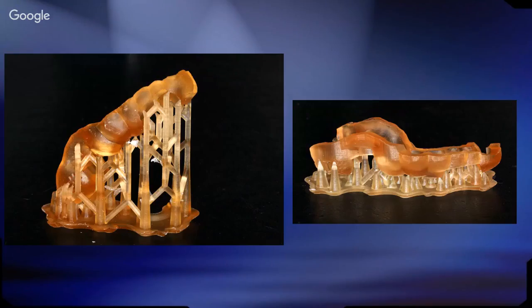If you look at the prints from, for example, a Form 2 printer, most printers will print at an angle for accuracy. You can print flat as well on some printers. What's kind of interesting about our work with the Xiav printers, we discovered it prints very accurately flat. So if you know anything about 3D printing, you know that the taller the object with the SLA type printers, the longer it's going to take to print. The nice thing about the Xiav, it's an LCD printer. It prints a full layer at a time. So printing flat actually speeds up your prints significantly.